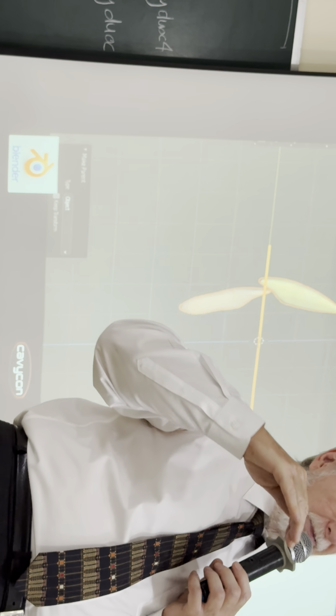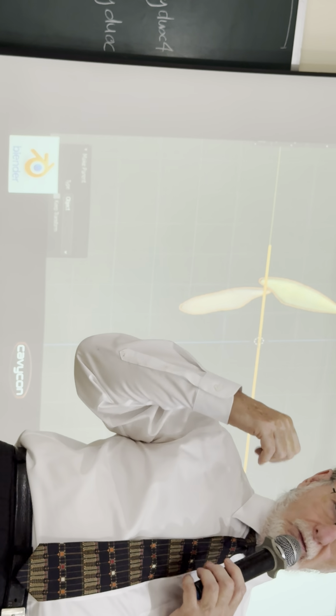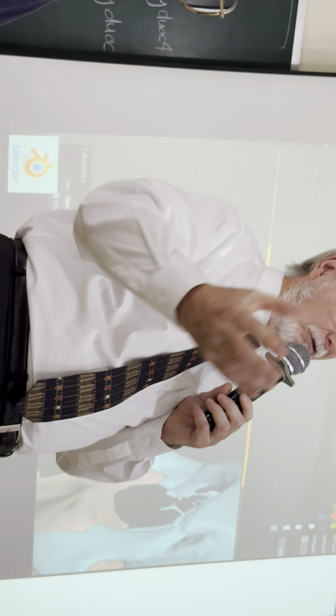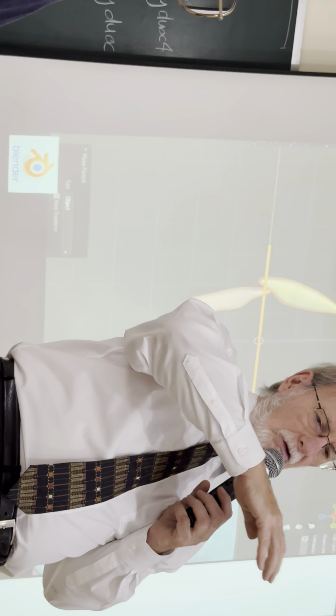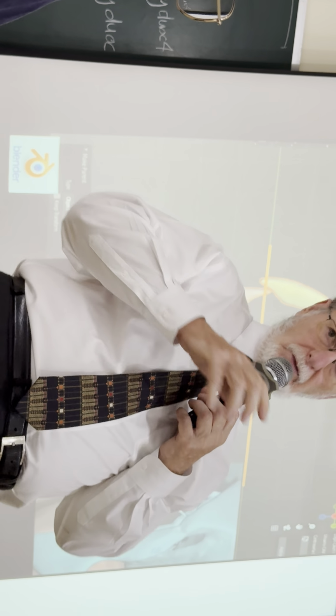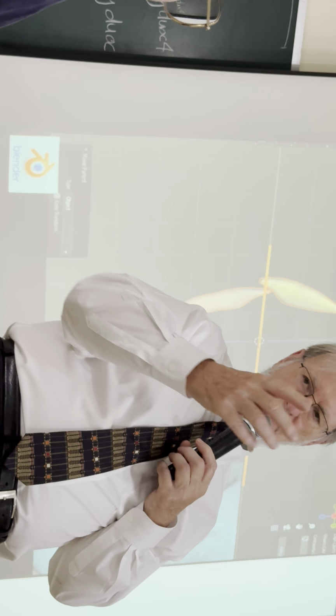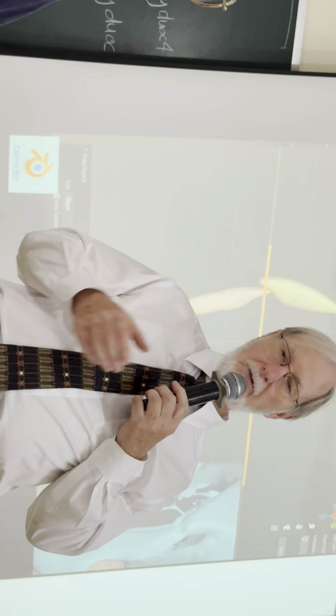TMJ. We made her a special splint with this technology. So first we make the splint. She got better, went good. Then I said, okay, we re-scanned her. We took the Cone Beam CT and the STLs into one file, and we simulated the surgery and the brackets, everything, until we were fully finished, and then we measure, send that to the surgeon, and that's it. We're done. Done the simulation, then we have to do the treatment.